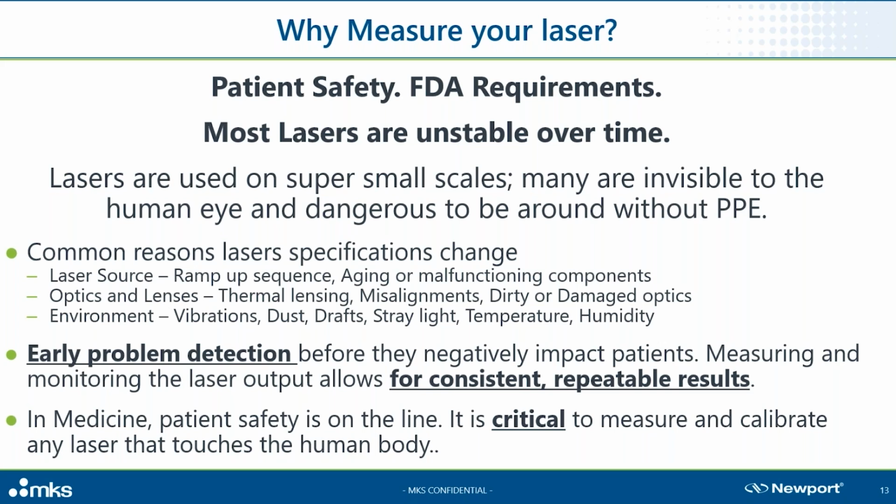A laser is made up of components, and over time, these components wear out, degrade, or sometimes totally fail. A chamber can heat up, causing glass optics, metal mountings, or adhesives to expand and contract, causing shifts or misalignments. Dust and humidity in the beam path can cause all kinds of degradation issues to the optics in the beam path.